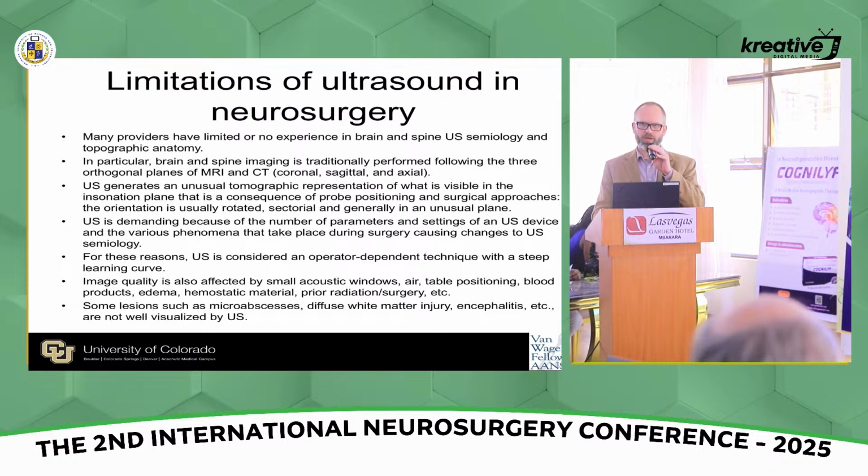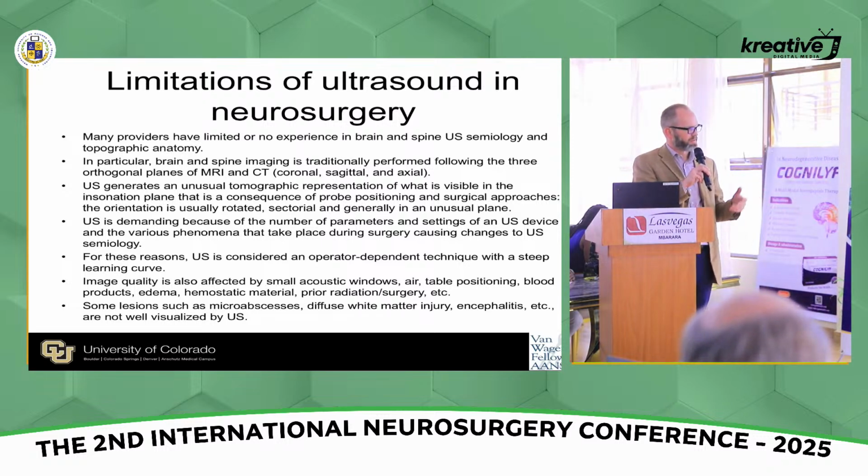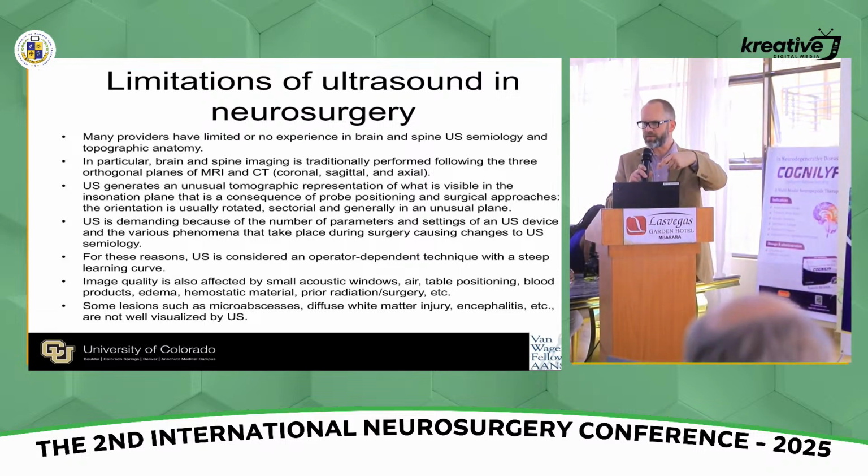Ultrasound is considered an operator-dependent technique. There's a steep learning curve, so it does take time and experience. Image quality is affected by small acoustic windows, air, and table positioning, right? Because you need to have your surgical plane horizontal to the ground so you can fill the cavity with irrigation, because ultrasound won't propagate through the air. Hemostatic material blocks the signal as well.